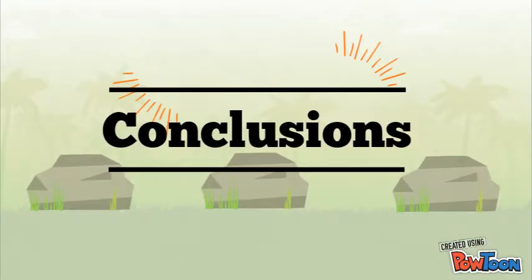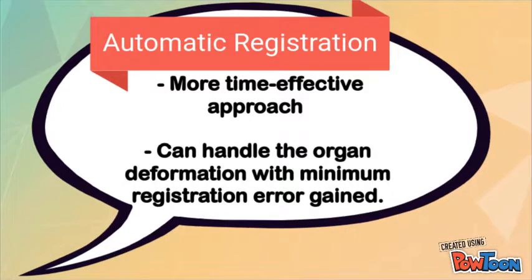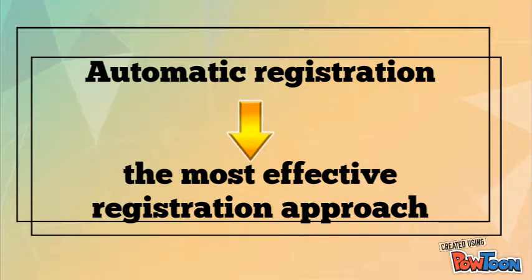Conclusions. The findings imply that automatic registration is a more time-effective approach, and it can handle organ deformation with minimum registration error gained. Automatic registration has been recognized as the most effective registration approach to increase the AR registration accuracy in laparoscopic surgery at the current stage.